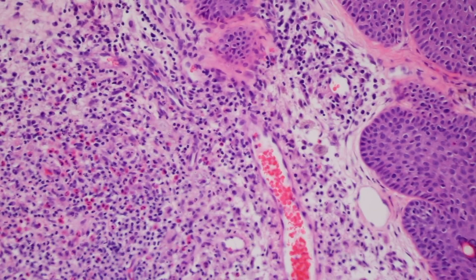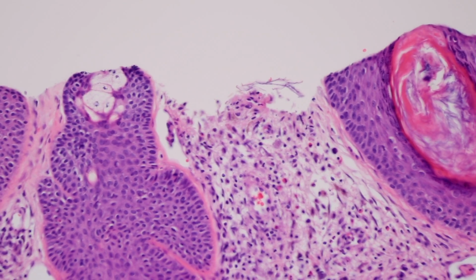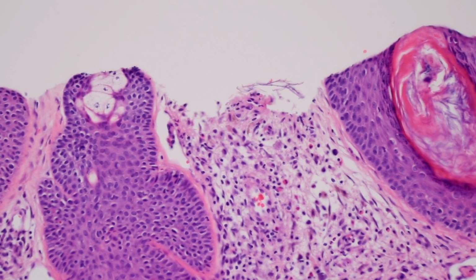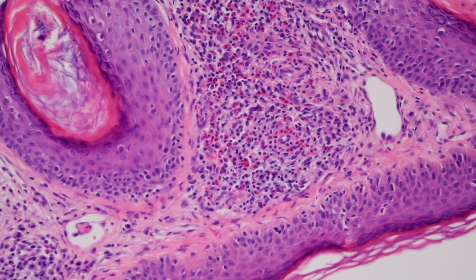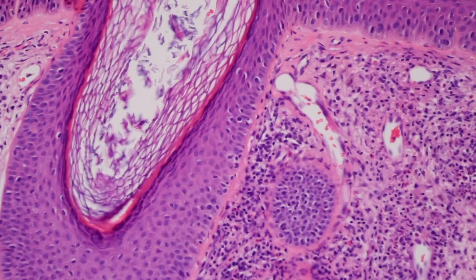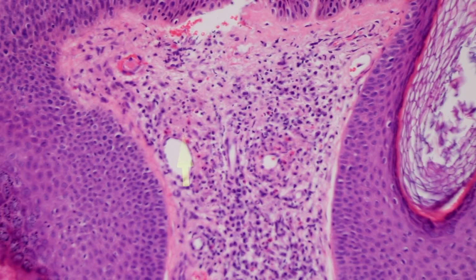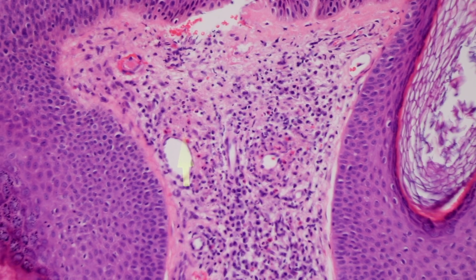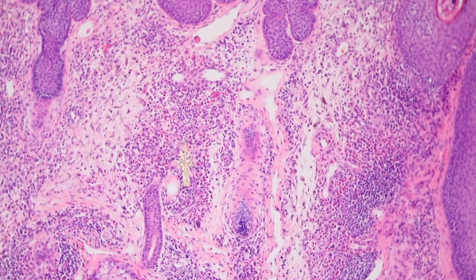And that vasculitis can vary, and it can be really focal. Here's another little vessel that looks like it's got some neutrophils around it just a little bit. Here are a couple other vessels surrounded by both EOs and maybe a few neutrophils. And there's a couple more. So you can have a little bit of vasculitis in this process, and sometimes it actually can be quite extensive and can even begin to get kind of sclerotic and fibrosing. Let me show you another example of that.